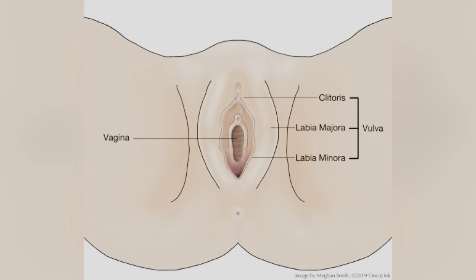If your patient is female, you need to use your non-dominant hand to open up the patient's vaginal lips. From there, use your dominant hand to clean the patient's vagina. Cleaning the female genitals will be slightly complicated because it depends on the patient's age and also the patient's physical condition, for example, if the patient has obesity. Male genitals are a lot easier because you can identify them immediately. Sometimes, people even mistake the urethral opening for the vaginal opening.